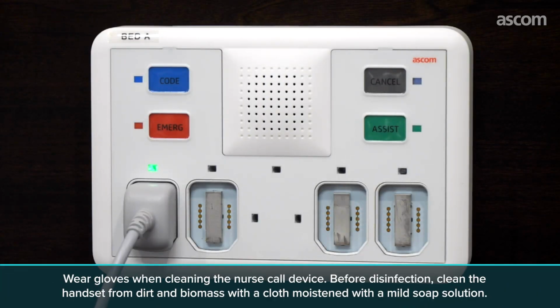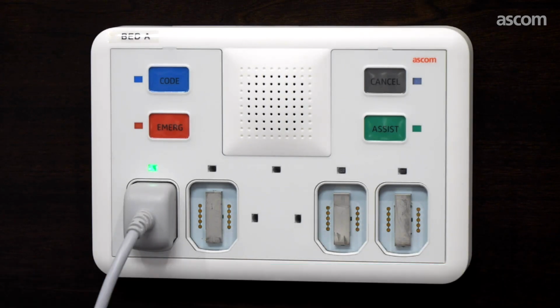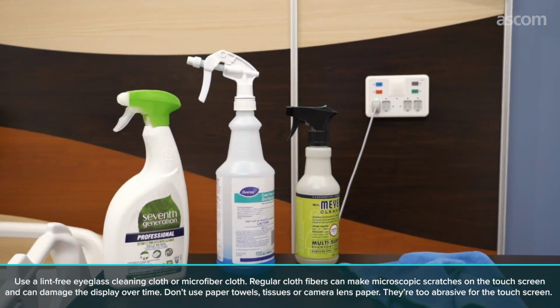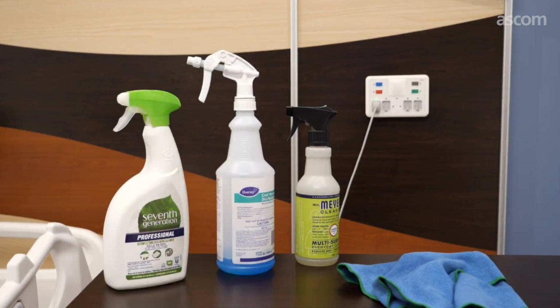Today, we're learning how to properly clean an Ascom patient station. There are 3 things to remember when doing this so you don't have Safe Connect pins corroding due to improper cleaning. First, use the right supplies. Use a microfiber cloth to wipe the station and make sure you use an approved cleaner.